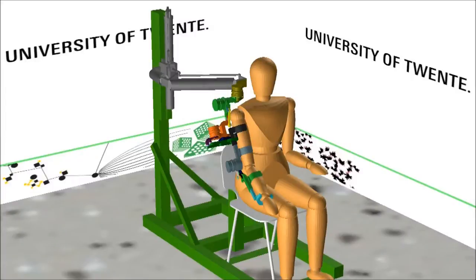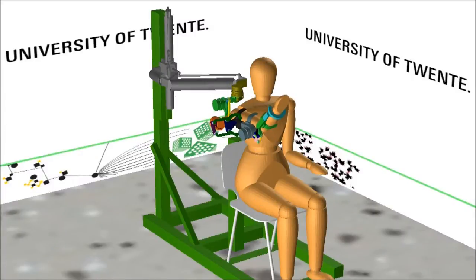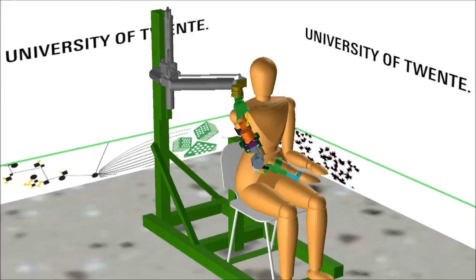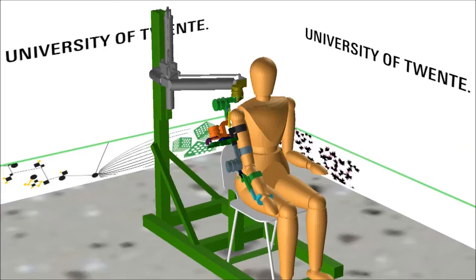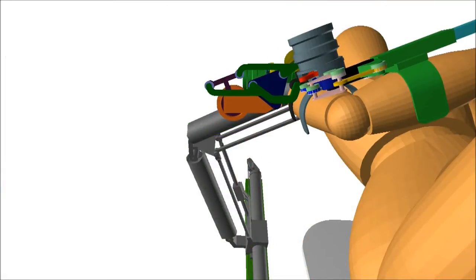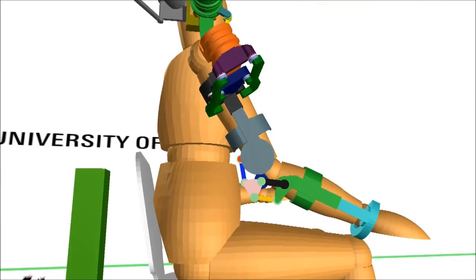A 20-sim model contains the kinematics and dynamics of the LIMPACT. The model is used to tune the outer loop position state feedback controller. Four cycloidal reference signals are selected. Amplitudes are set at 80% of the corresponding joint's maximum working range.